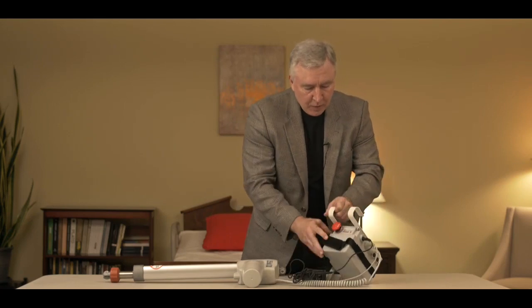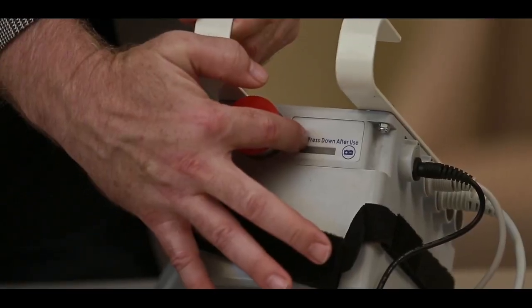When you plug it into the wall, you'll see at the very top here that all the lights will light up on the display, indicating that it's charging.